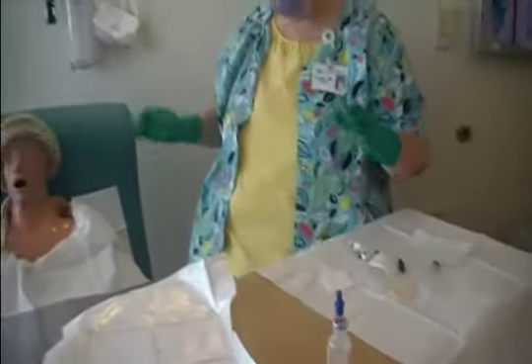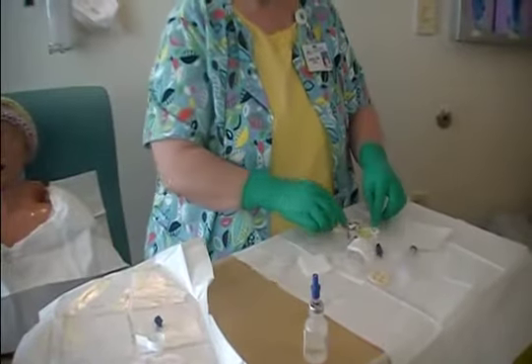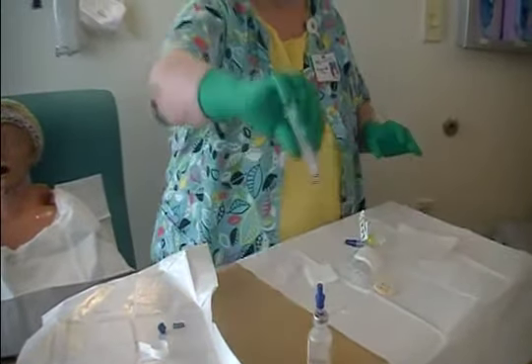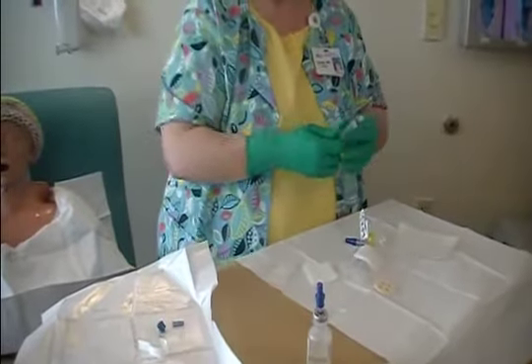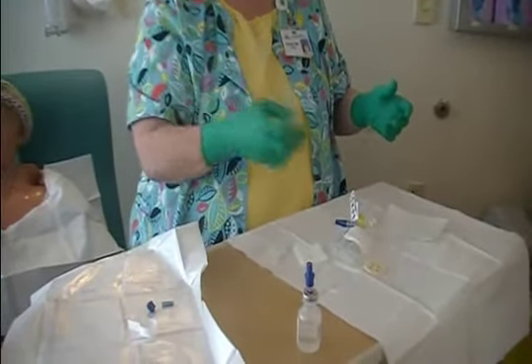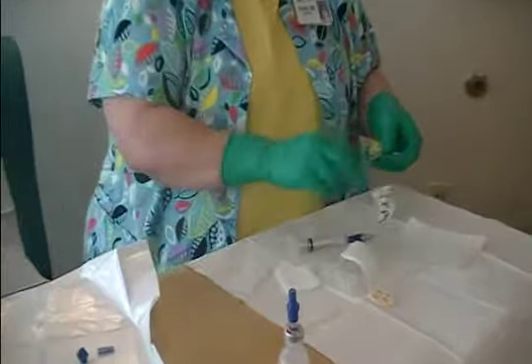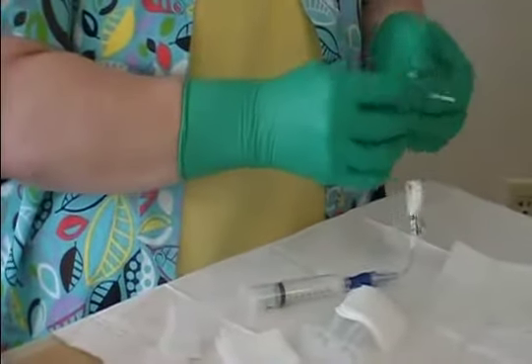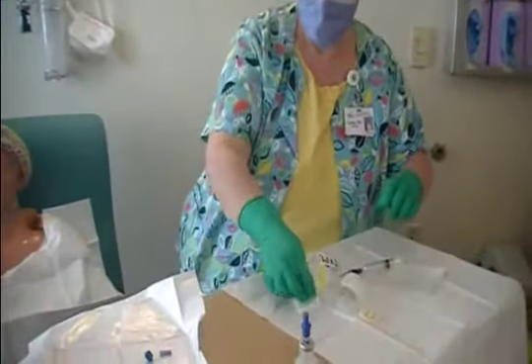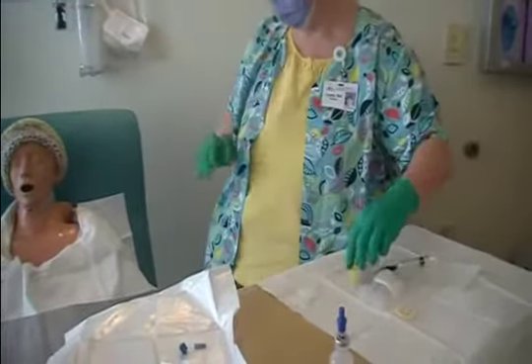I keep starting in the middle and working my way out all three times, scrubbing with the chloroprep. That's going to dry, and in the meantime I can come back and get my needle ready. I'm putting this on — I would have already drawn up the normal saline syringes beforehand. I have my 10cc of saline and I'm going to flush it just until I see fluid come out of the end. If the chloroprep isn't quite dry yet, you can take some of the gauze from your sterile field to take a little of the excess off, but really let it dry as long as it needs to dry.